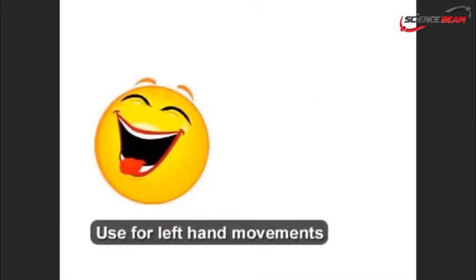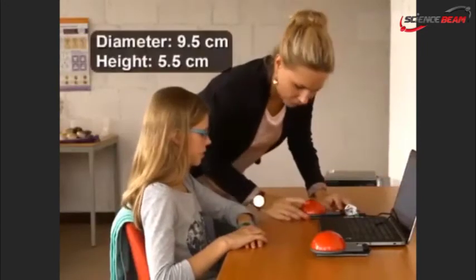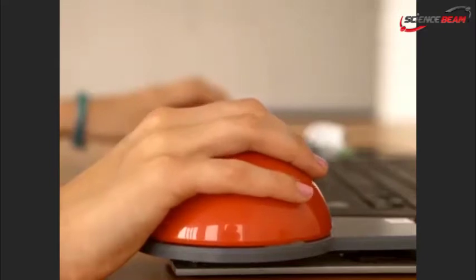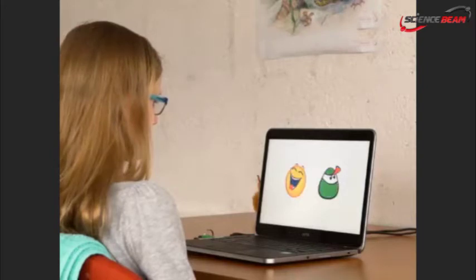For designing a visual target response, begin with choosing visual stimuli that are easy to distinguish based on the color or shape. Present the stimuli to the left or right side of the screen to respectively induce left or right hand movements. To register the responses to the stimuli, provide the subject with two big response buttons with very low force requirement to ensure that the subject is easily able to respond. Use response devices that can register button presses accurately and deliver related stimulus markers to the EEG computer in time.